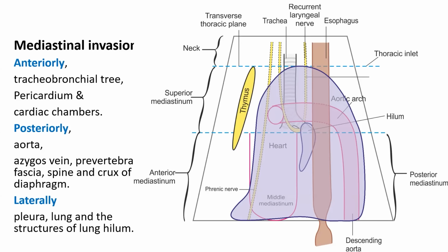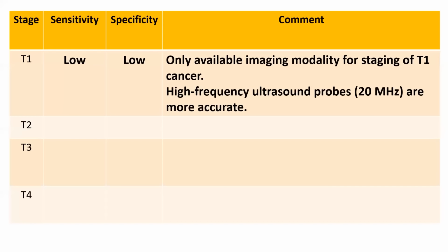Generally, people take this mediastinal invasion casually. No, which part of the mediastinum is involved? That is what we must assess.